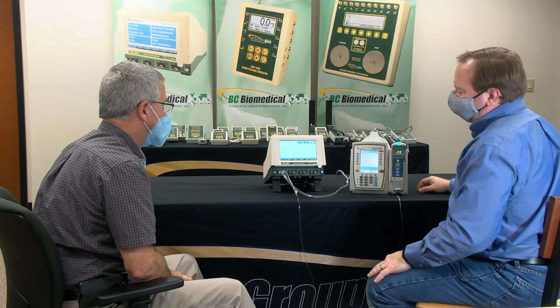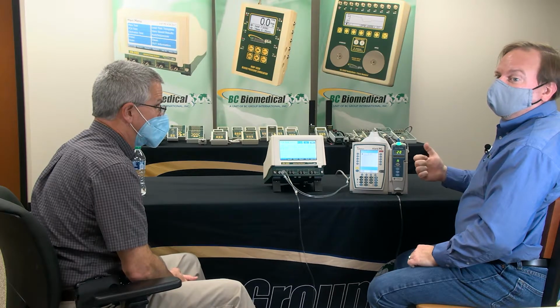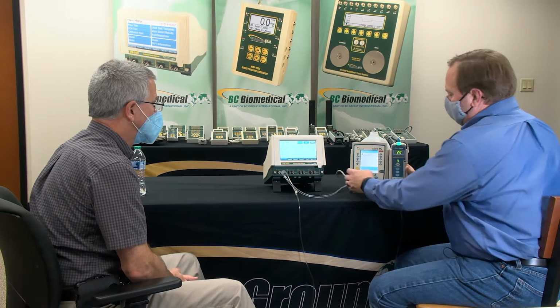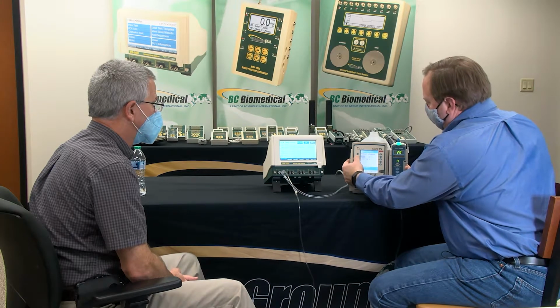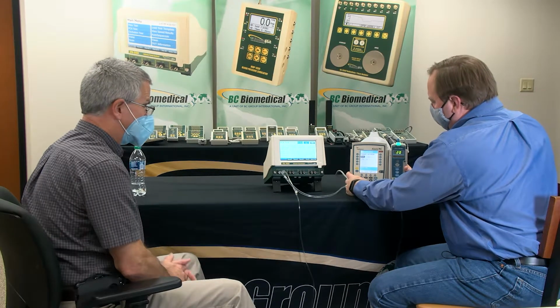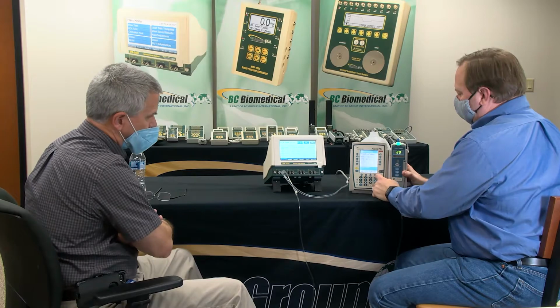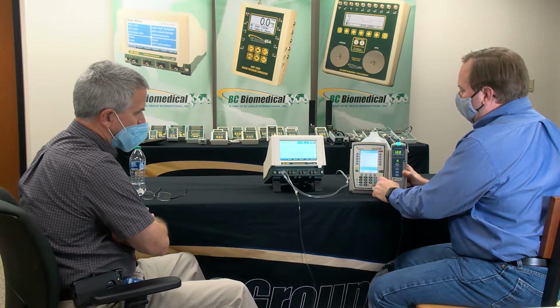Yeah. So if you hit a PCA pump, are we testing the lockout too? You would be testing lockout. So you would want to hit that 6 times instead of 5. Right, you lock out after 5, so it's the 6th press when it locks you out. Yep, thank you, that was the other part of my question. Now, we do have hardware in the 3400 to be able to do that.